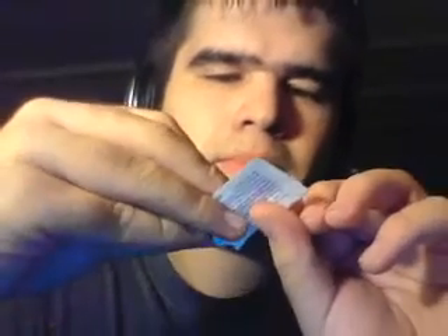And look — not a drop of blood, just a bit of broken skin. So that, guys, is the Metapoint Splinter Out Tool. I'll go ahead and leave you a link to where you can get them — they are pretty awesome. And I want to give a huge shout out to Metapoint for sending out these splinter out tools. They are super amazing. And a quick tip for when you're throwing them away: take the sharp end and put it into the cover or into the packaging, with the point facing towards the end, so that it doesn't poke through the side of your trash bag or anything.